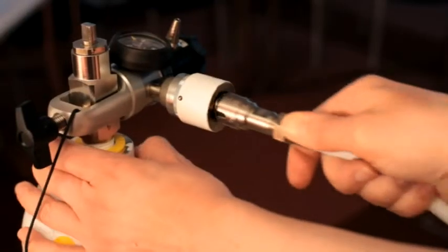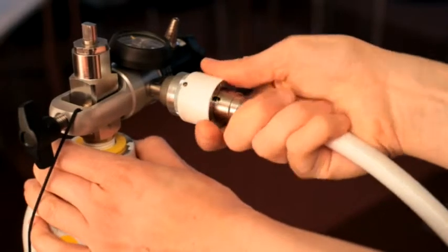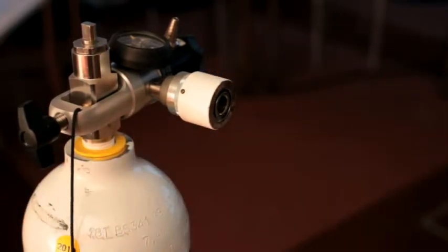A Schrader fitting can be attached by pushing it into the socket firmly until there is a positive click and it locks in place. The probe can subsequently be removed by rotating the socket collar clockwise.